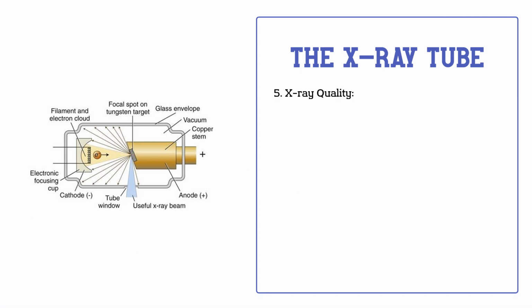Because the emitted X-ray has a spectrum of energies up to the maximum applied voltage in the tube, it is hard to characterize the emitted X-rays in terms of energy. Although the average X-ray energy is approximately 1/3 of the maximum energy, it still cannot be used to describe the produced X-ray energy, especially due to filters, as filtration significantly alters the average energy.